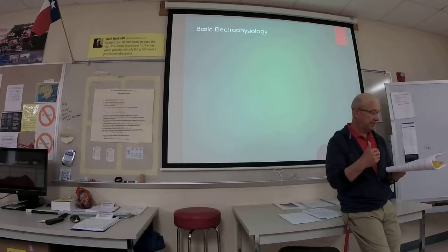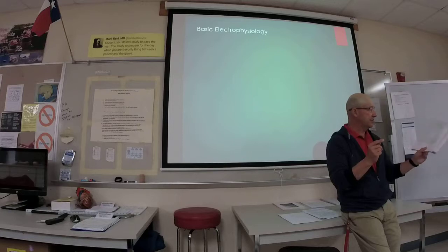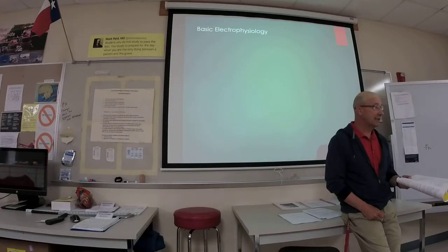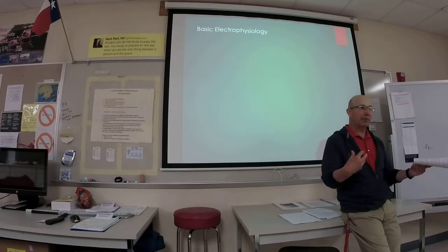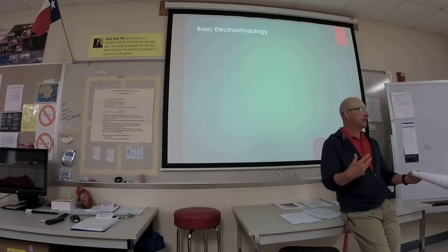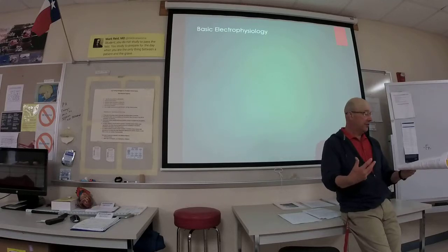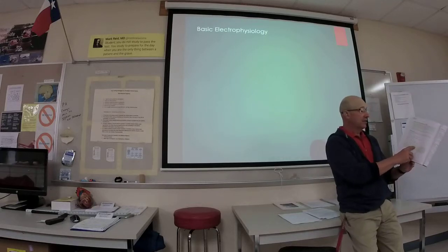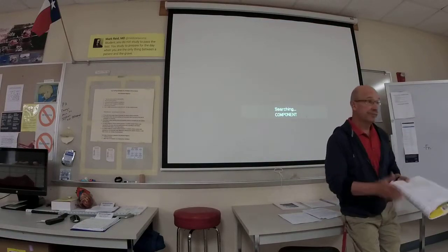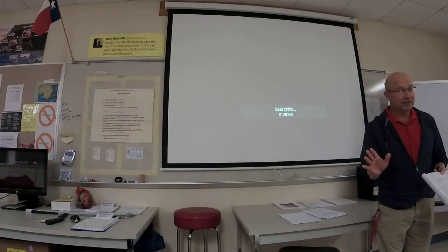We talked about supplies. Down at the bottom, again, good test questions: have the bladder empty prior to the test, rest for at least 10 minutes. Now, I'm a pre-hospital person, so 10 minutes, no. But in a doctor's office you might want them to rest for 10 minutes and go to the bathroom. Here it said preferably 30 minutes of rest before the EKG. Again, just a good test question.